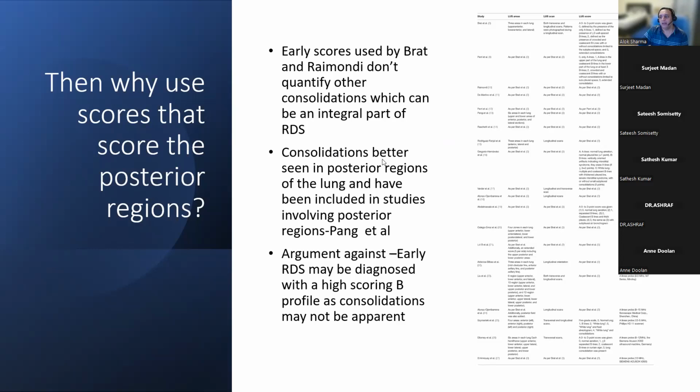Now, if you want to use the posterior regions, that's fine. But there is no current evidence, including this meta-analysis, that shows that the use of the posterior regions confers any advantage over simple anterolateral scanning or using Brat's methodology for the purposes of scoring and determining whether a baby will need surfactant therapy or not.